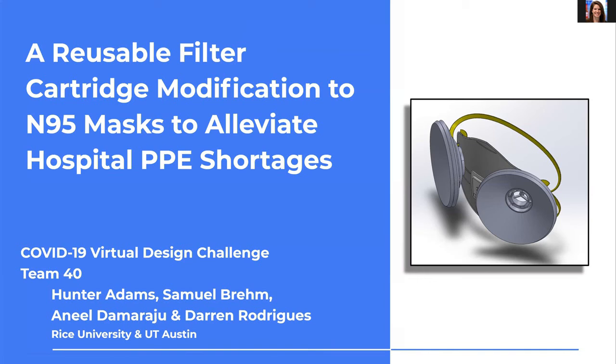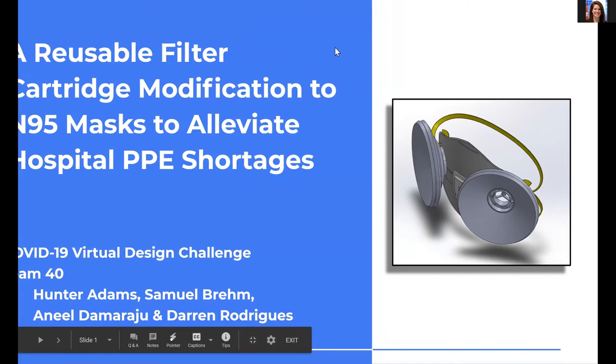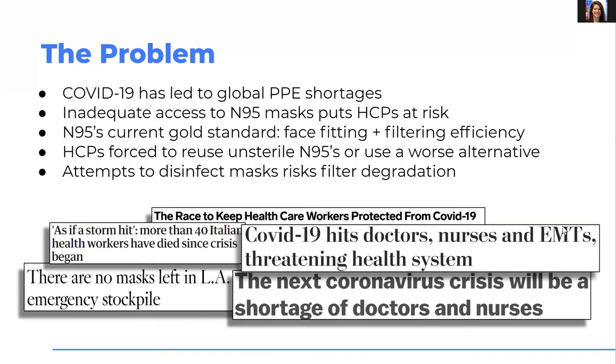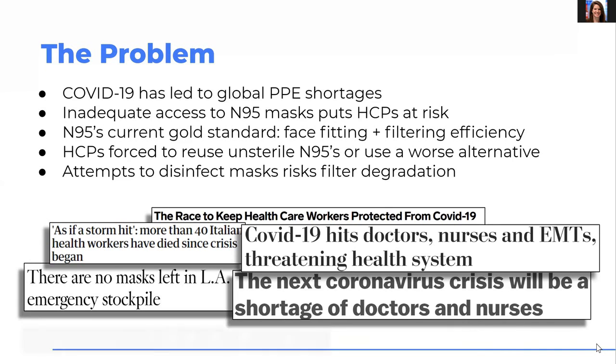So, as we all know, the COVID-19 pandemic has led to shortages of PPE, and the N95 is in particularly short supply. This is because it's the gold standard for non-powered face masks due to two qualities. Number one, its filtration efficiency, and number two, its face fit. Currently, healthcare providers are either reusing unsterile N95s, which is obviously bad for health reasons, or they're attempting to disinfect N95s, which leads to filter degradation and other things, or they're using alternatives, which either don't offer good enough filtration or don't offer good enough face fit.